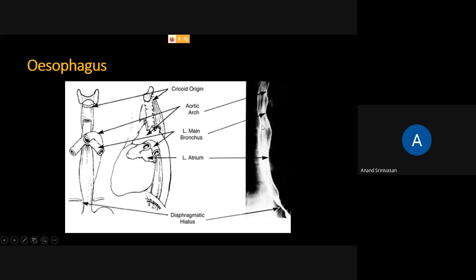This is very important. It's a barium swallow because the picture is taken when the person swallows. After the swallow, it is called barium meal. So the time of swallowing is called barium swallow.